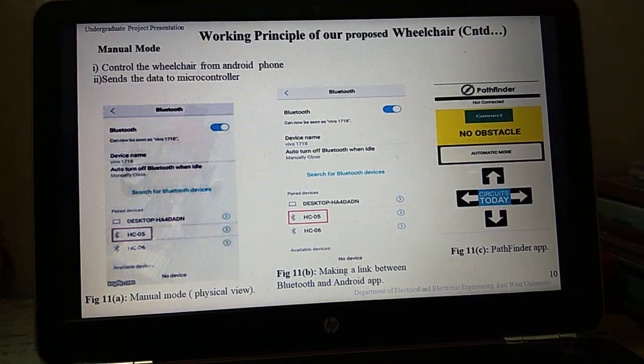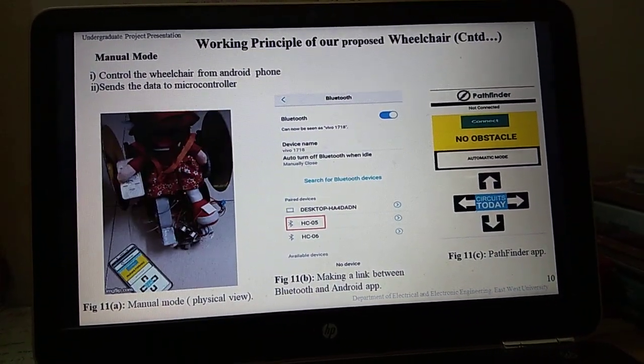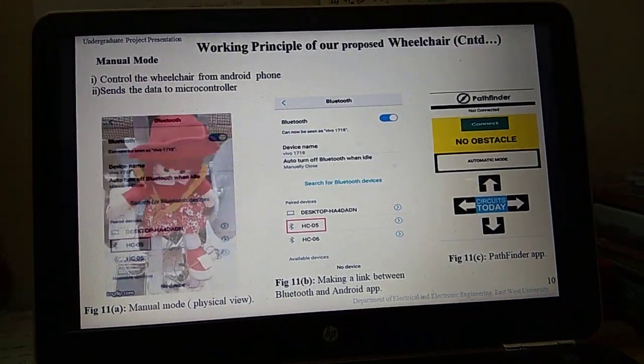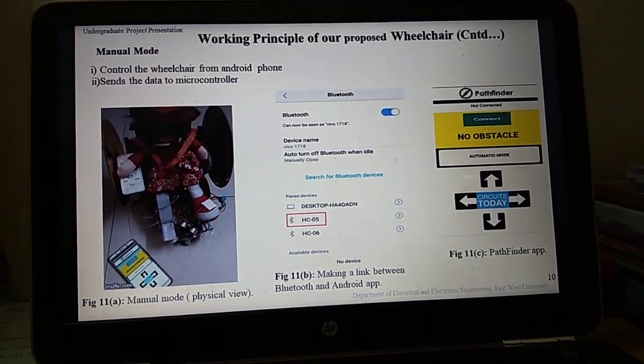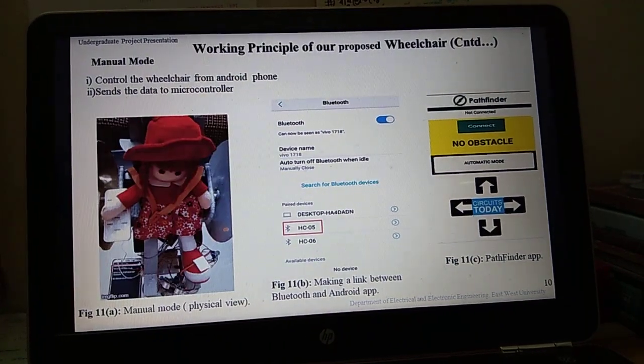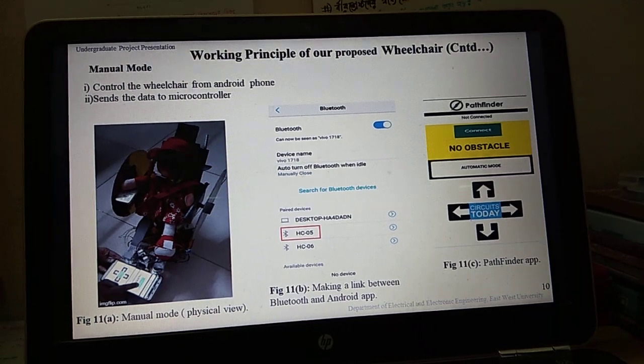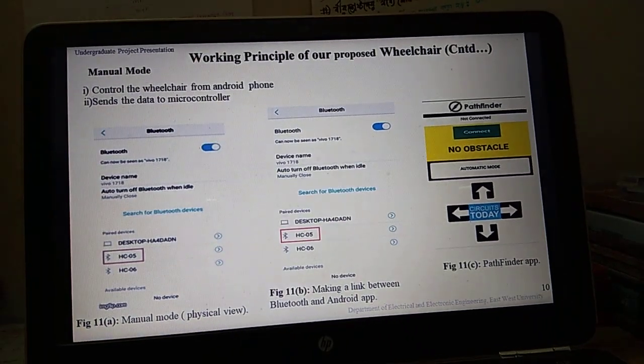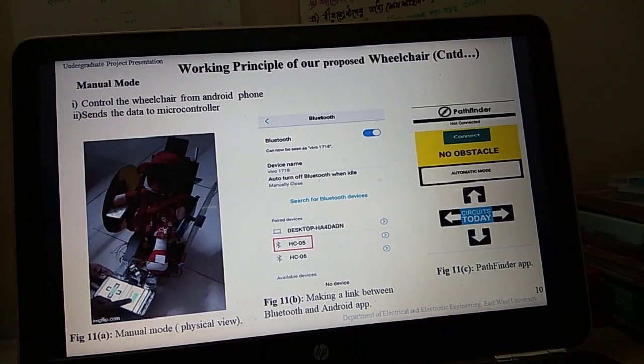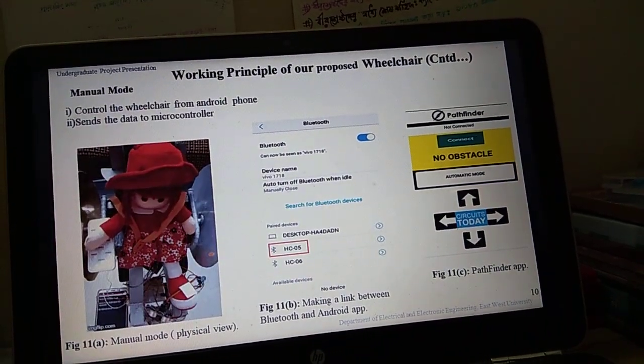After activating the Bluetooth, the smartphone will find the HC-05 Bluetooth module, then it needs to pair the device. After pairing the device, it needs an application for controlling the Arduino Uno. In this project I've used Pathfinder app which is available online. The app is for controlling the wheelchair. The smartphone is the transmitter of the wheelchair. It sends the data to microcontroller through Bluetooth module. It also helps to send instructions of forward, backward, left, and right to the microcontroller. Actually the smartphone is used as a remote of this system.